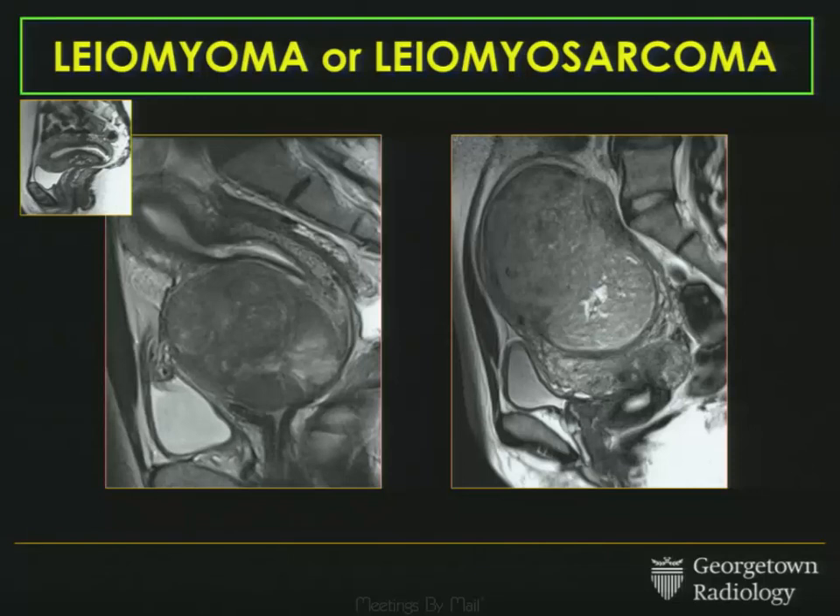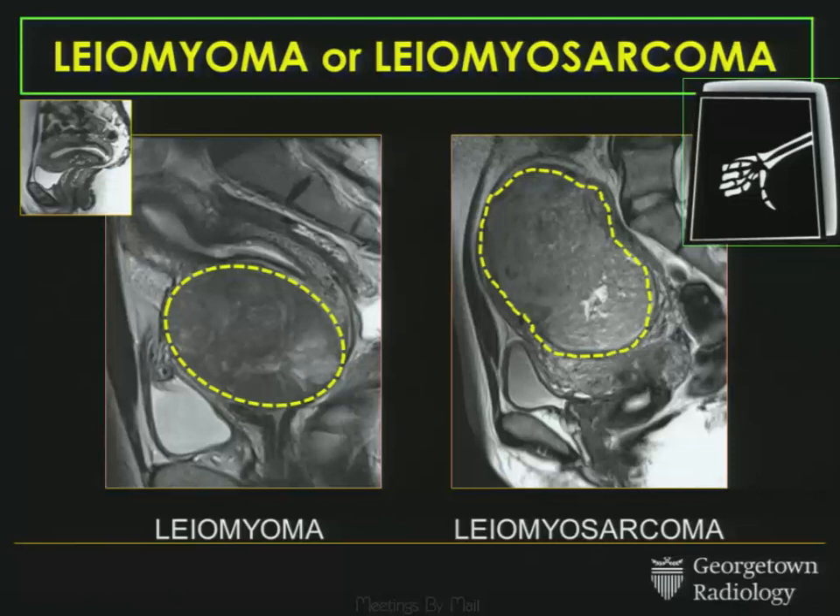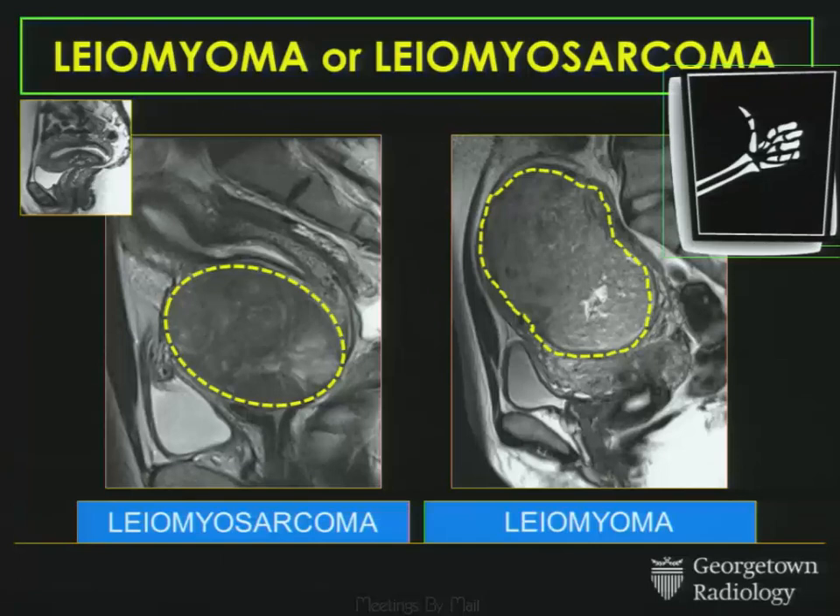Last case. Two different patients, two dominant lesions. We have to make a decision about them. Which one is the leiomyoma? Which one is the leiomyosarcoma? You might be tempted to say the one on the left is the fibroid and the one on the right is the sarcoma — but you'd be wrong. In fact, the one on the left is a sarcoma, and the one on the right is a degenerated fibroid.